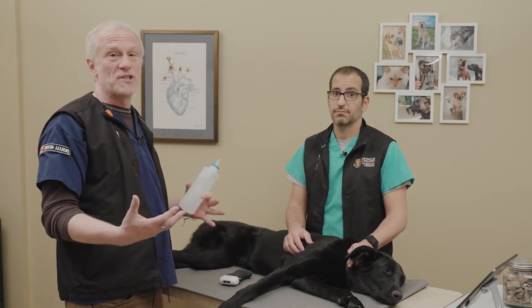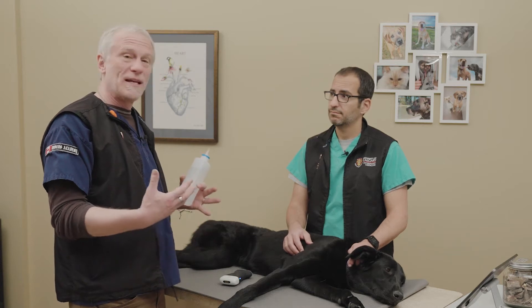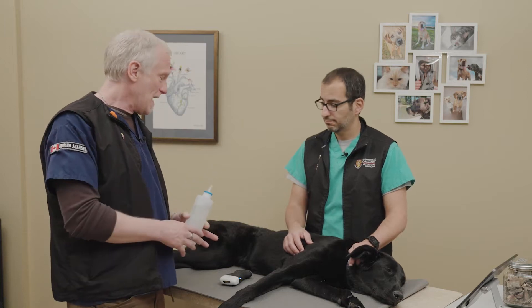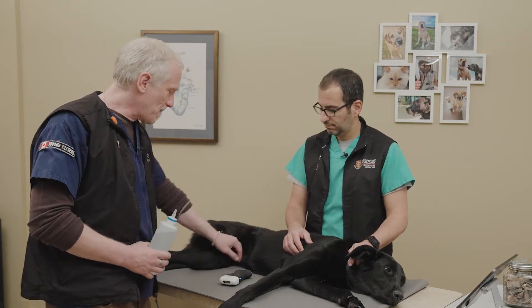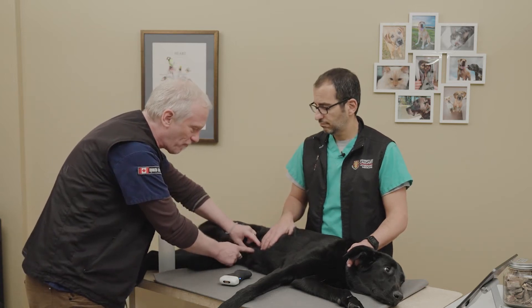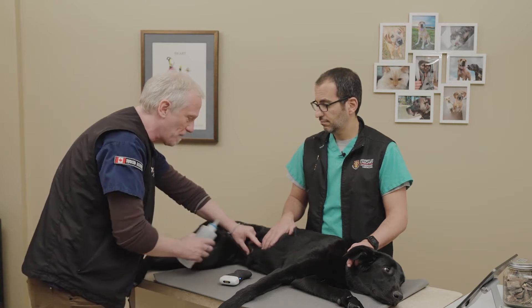So we're thinking, for example, if we're looking for free fluid, one of the key things we look for at that umbilical site — we've got to think about patient positioning and where pathology accumulates. In this case, we're looking for free fluid. If our patient is in lateral, as Penny is now, then we come back to that umbilical site. We find it simply by separating the fur, finding that scar from when they had their ovariohysterectomy in our female dogs, or at that umbilical site in our male dogs.